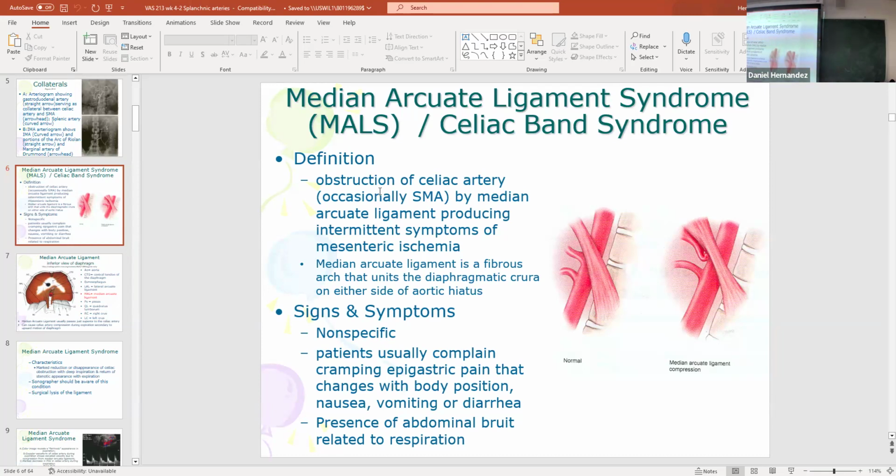It straightens out, the velocities drop down to normal range. How does it compress it though? Just where it's affixed and where it's overlying? I don't know. So that ligament's going up and down with your breathing. And you have, let me see if I have it. It's like compressing, I'm thinking something's pushing on it.